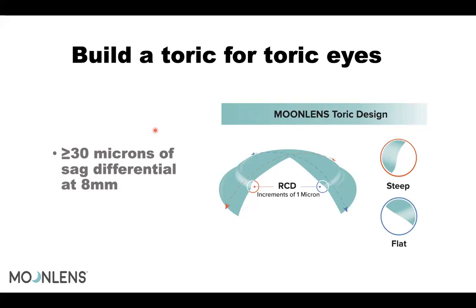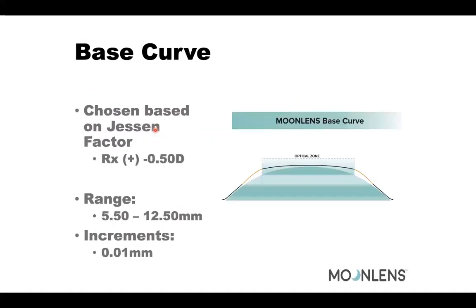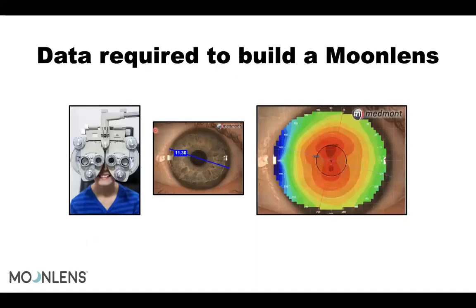And it's going to be just the regular assessment with an Ortho-k. You're going to have the dispense of the lens, and with the dispense of the lens, you want to go with a fluorescein pattern. My suggestion is don't go making changes based off the fluorescein pattern, because even if you aren't able to get, let's see, we have one image here of a fluorescein pattern.